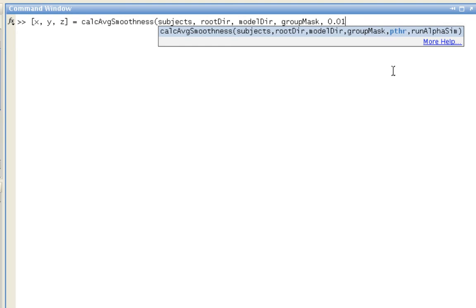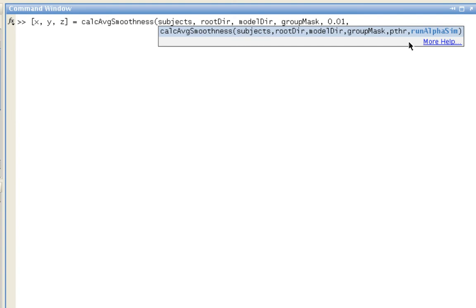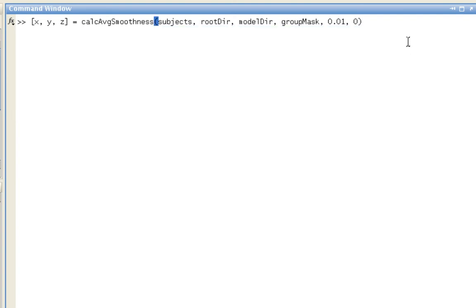It's like 0.05, 0.01, 0.001, and so on. This last one is a flag for whether you want to run 3D CLUSSIM. It's called alpha-SIM here, but it's really 3D CLUSSIM. 1 represents yes, you do want to run it, and 0 represents no, you do not. For this purpose right now, I'm not going to run it.